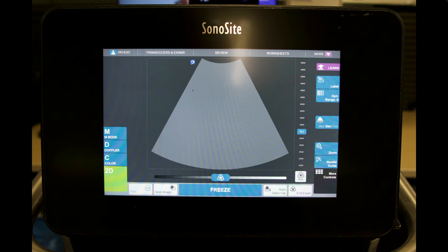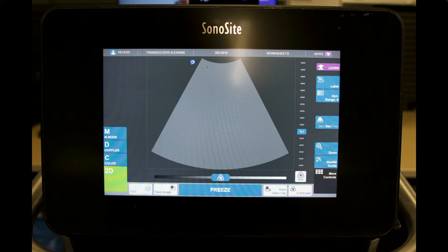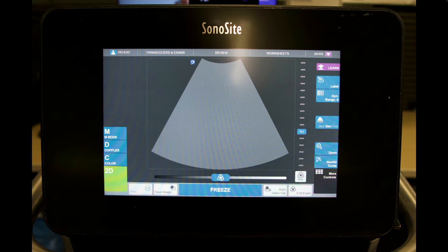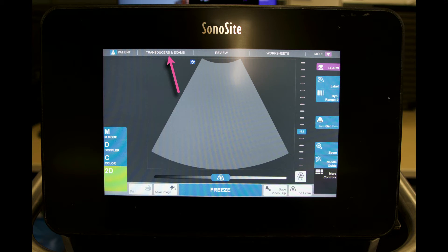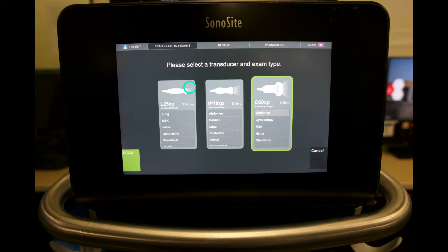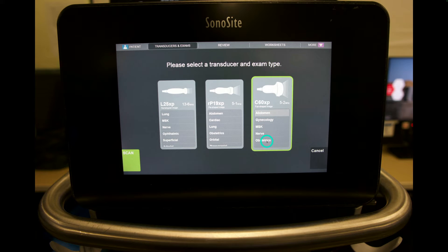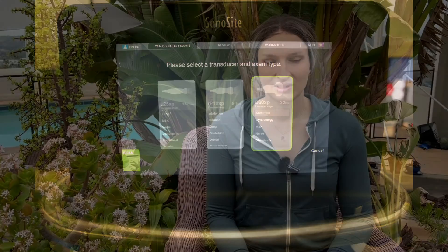Now, if you need to change the transducers, for example, this right here, there's a curvilinear transducers wedge right here. Let's say you don't want to use the curvilinear. You want to use a different transducer. Go ahead and hit this button right here, the transducers and exams, and it'll take you to this page right here. And you can decide if you want the linear, the phased array, or the curvilinear transducer, as well as which setting within each transducer you need.